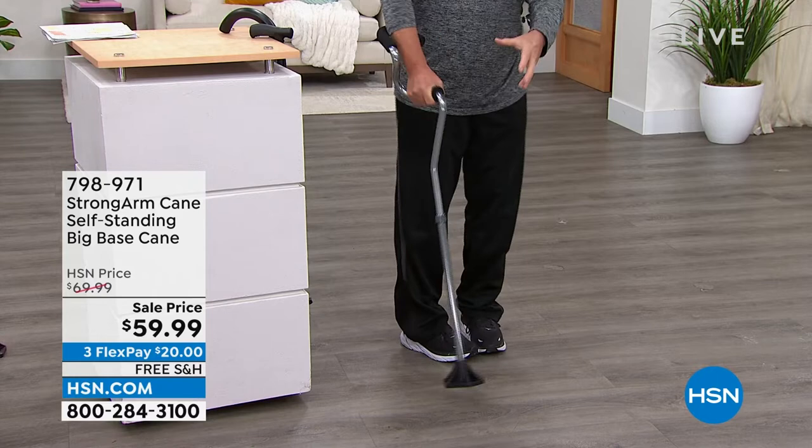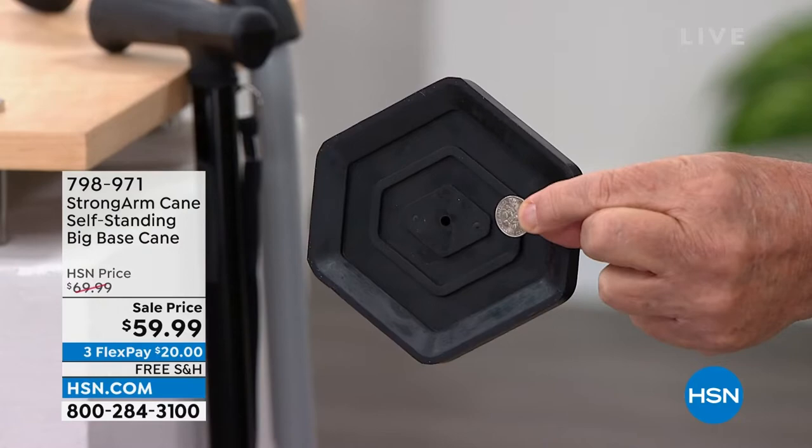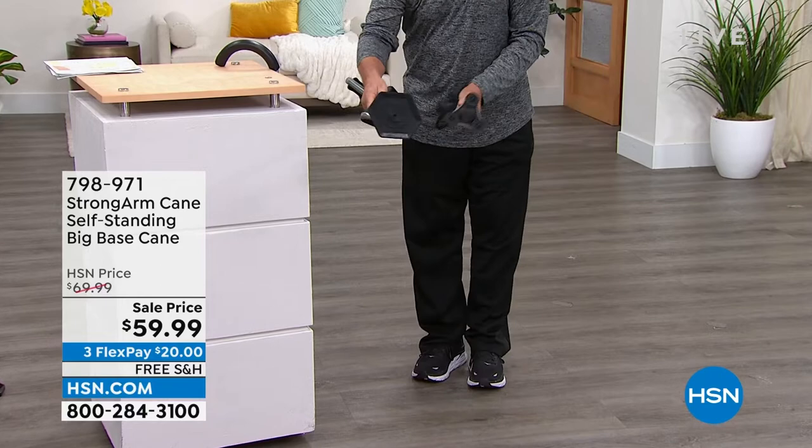But look at this base — look at the size. I want to give you a comparison: here's a dime, look at the size we're talking about on that base. And here's another popular item out there with kind of a base to it — look at the difference. It's like a dinner plate on the bottom, no question.